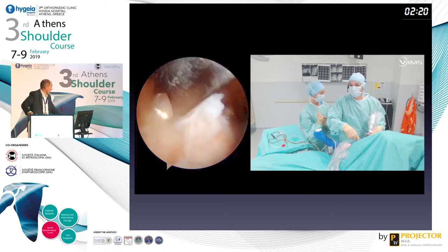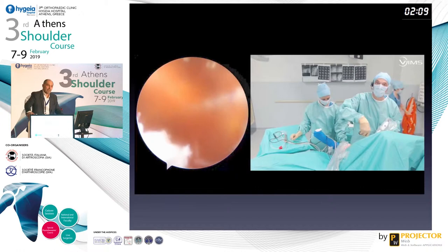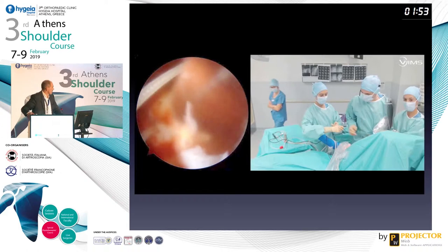This is the upper part of the footprint of my subscap. And you can see here the distal part of the subscap, the humeral head. In that situation, I tried to make a partial repair of the subscap in addition. So this is the reason why you can see some white sutures and other anchors at the upper part of the subscap. But this is the footprint of the subscap. Now you pull up your transferred tendon and you control whether it's able to reach the upper part of the subscap.